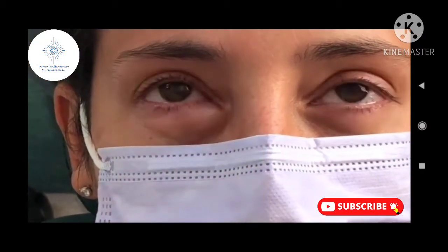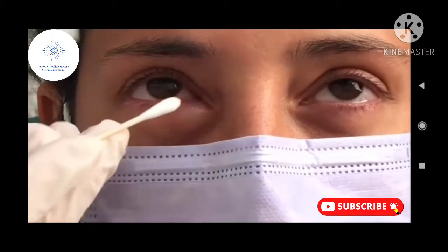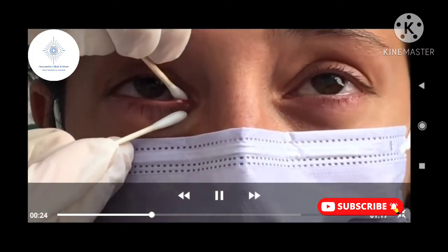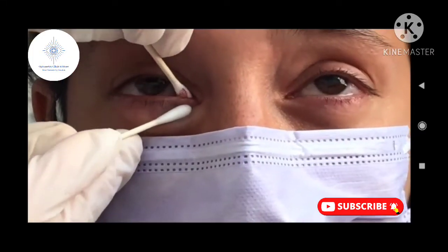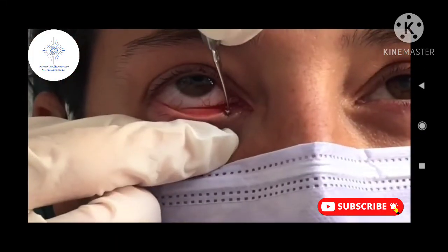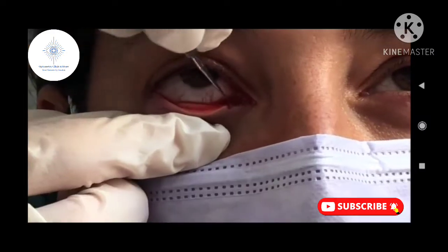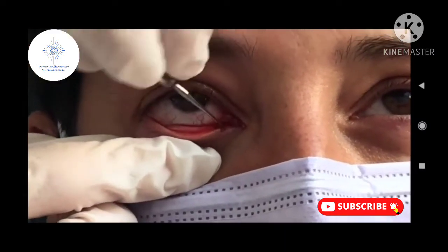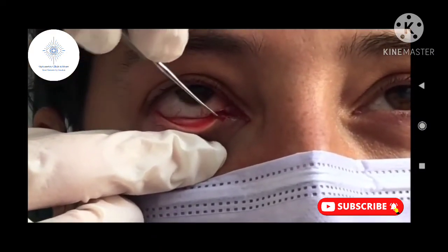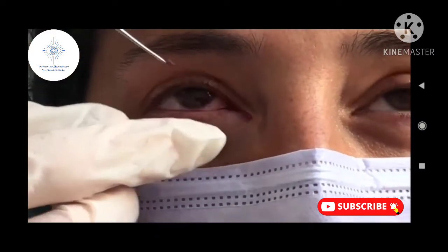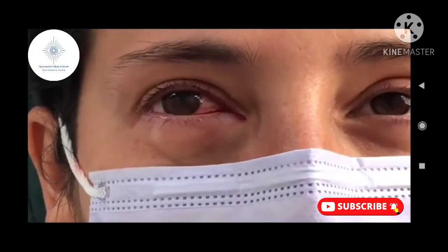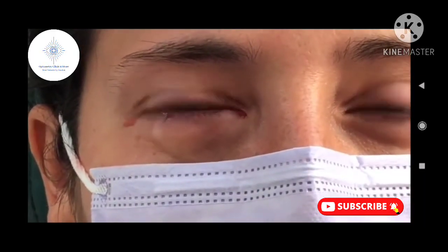Then gently dilate the punctum and canaliculus with a punctal dilator. With very minimal pressure, lacrimal stones can then be removed with two cotton tip applicators, but the gold standard remains debriding the canaliculus with a chalazion curette.